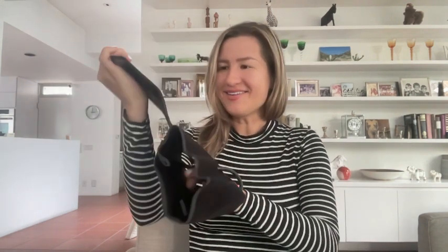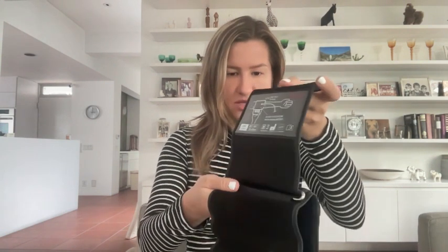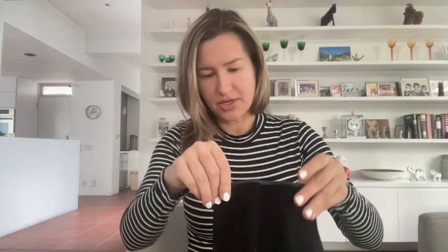Here is the cuff — it shows you the exact placement for your hand. Basically, the wire should match your artery. This is your vein right here, and we're supposed to connect this wire to the device.